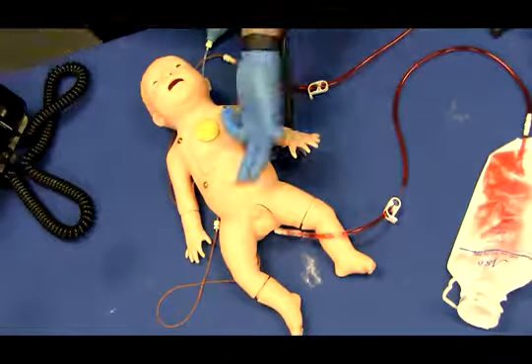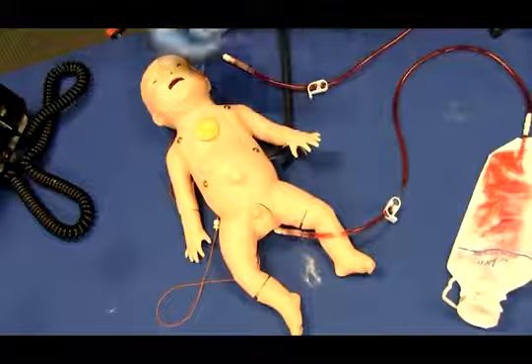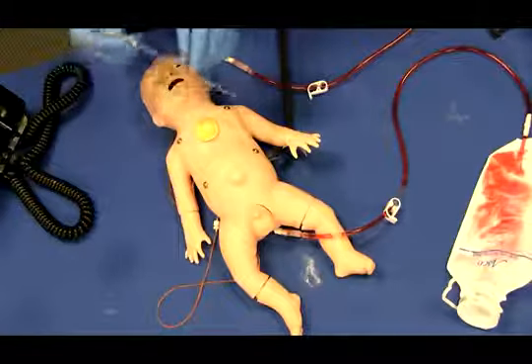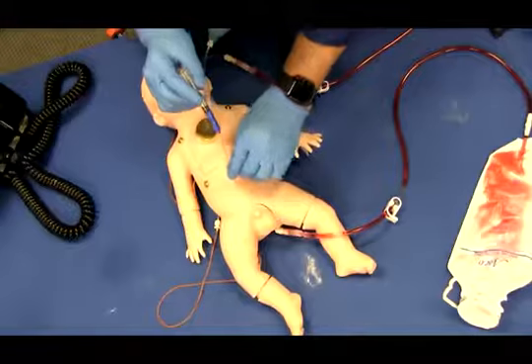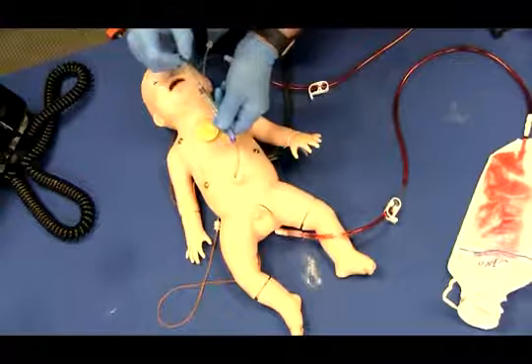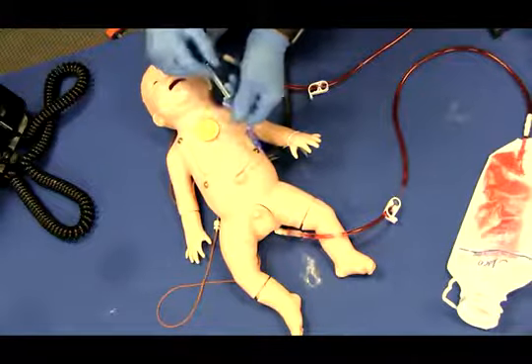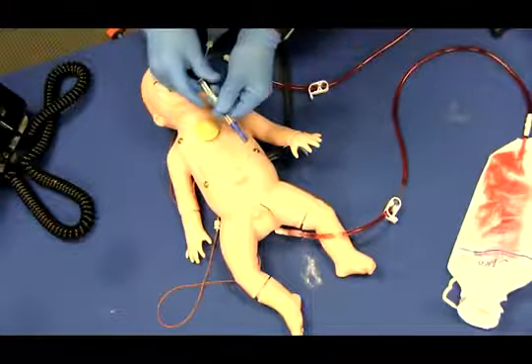Umbilicus. The umbilicus may be catheterized through the vein or the artery. With the reservoir already filled, you may lubricate the catheter and follow institutional guidelines to withdraw blood. To infuse fluids, leave the reservoir empty and follow institutional guidelines. The maximum cavity capacity is approximately 5 cc's of fluid.